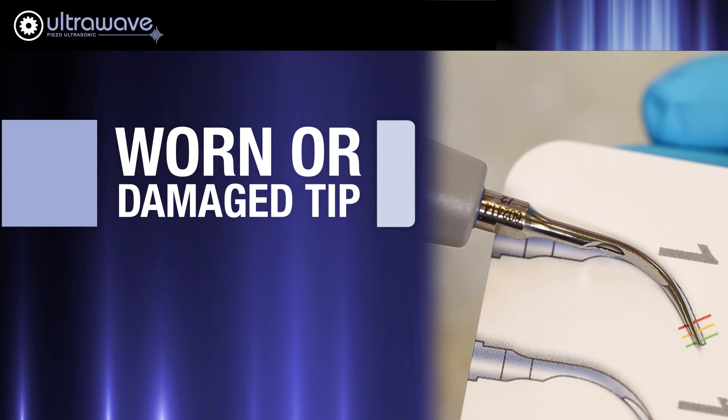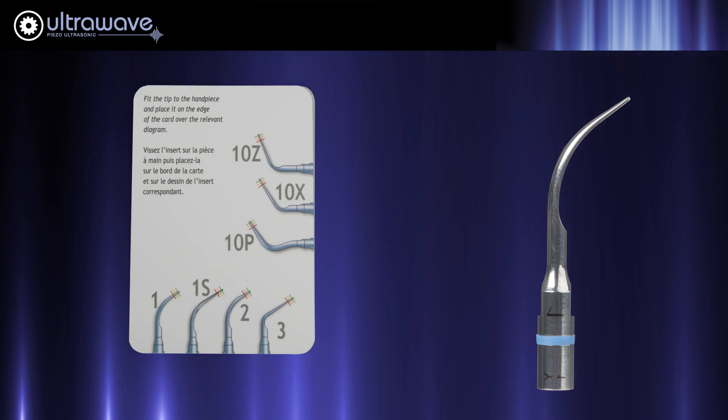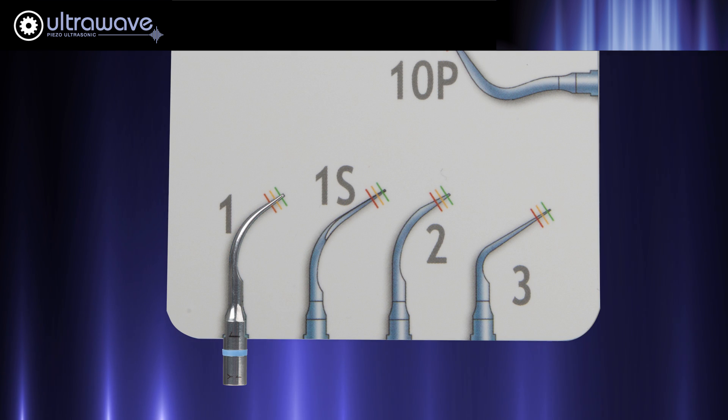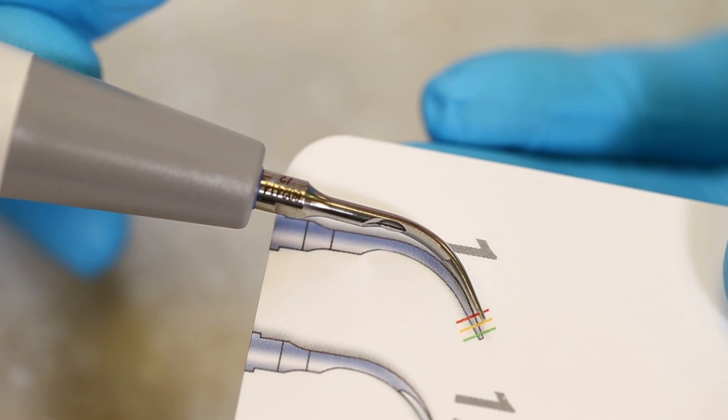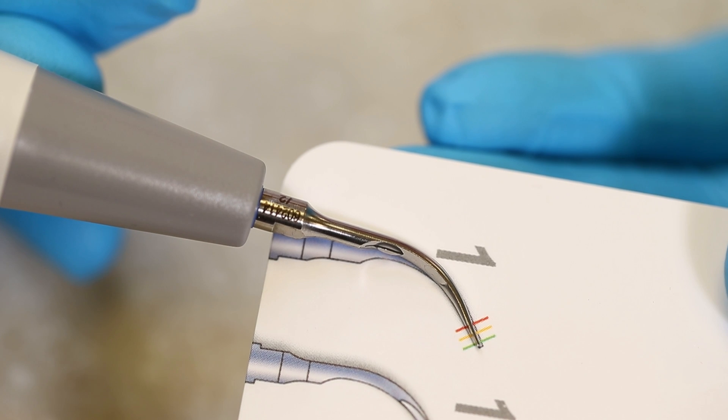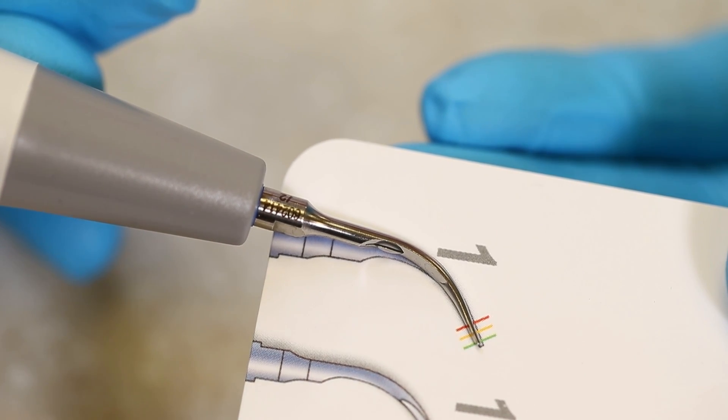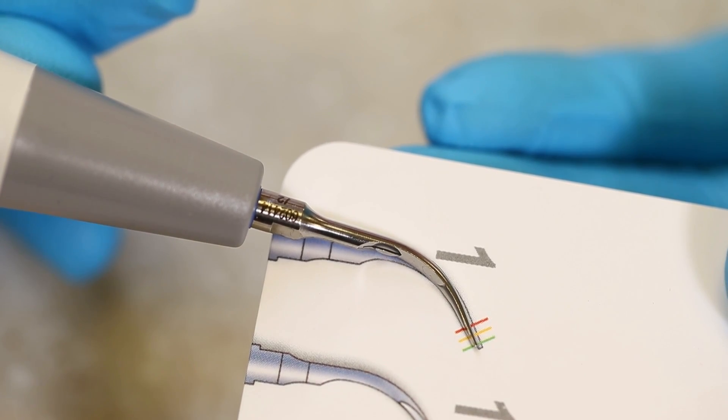You can check this by comparing the tip that you are using to the tip card included with your unit. On the tip card, there are three lines. If you find that your tip is worn down below the yellow or red line, it should be replaced with another ultradent satellite tip.